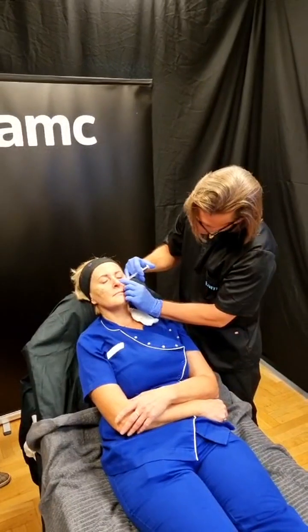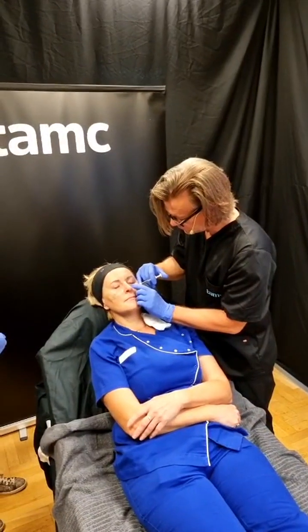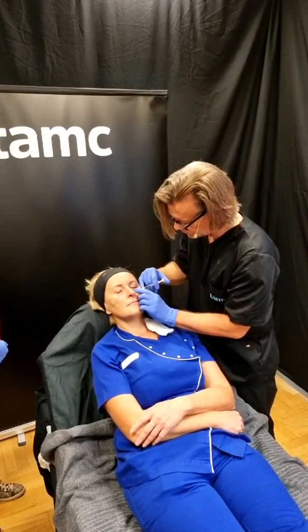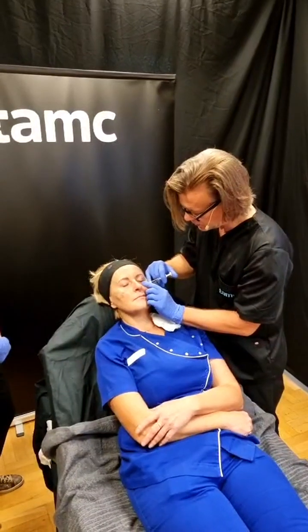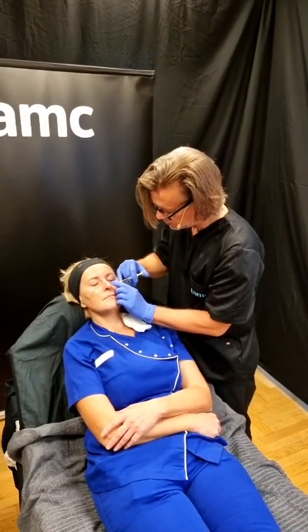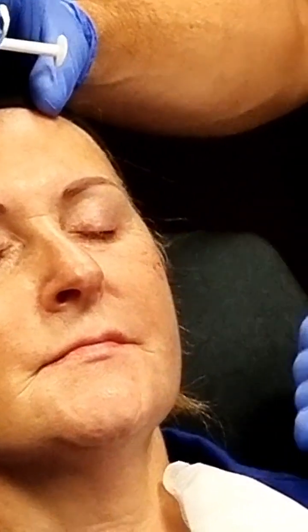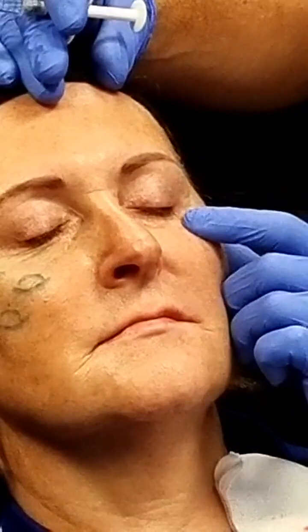Since I cannot see the needle tip, I have to watch my plunger. That tells me I put in 0.1. At the same time I can feel with my index finger here, I can feel the gel coming. And I feel the little hollowness repair. And you see reduction of that depth.